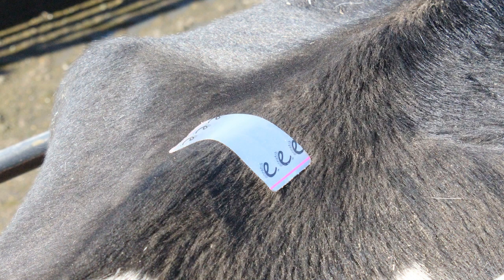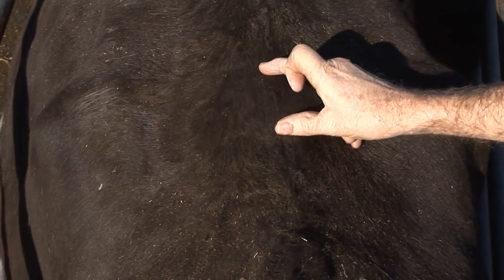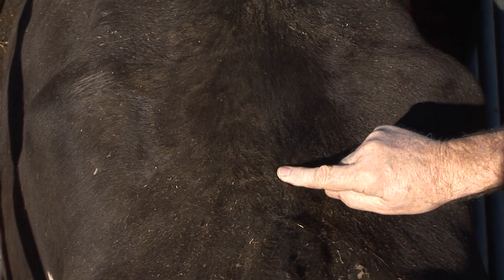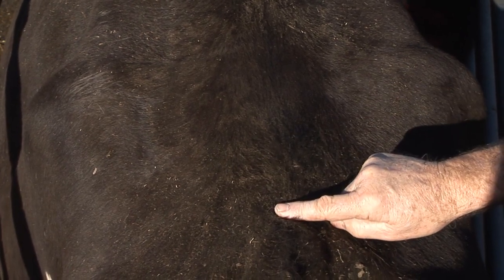Select the site by lining up the front of the detector with the hips and centred above the backbone. For larger than average cows, position slightly more towards the rear. Never place the detector in a depression, as this may prevent enough pressure from the riding cow to activate the detector.